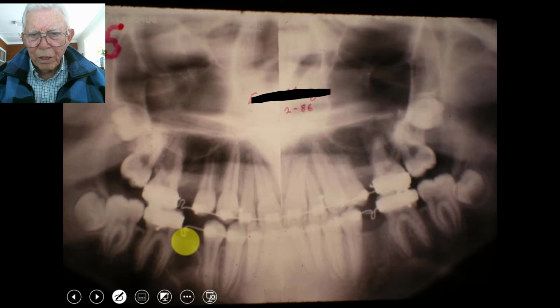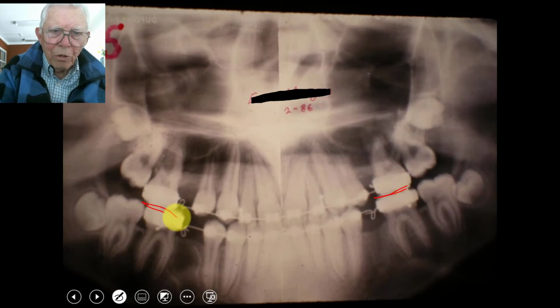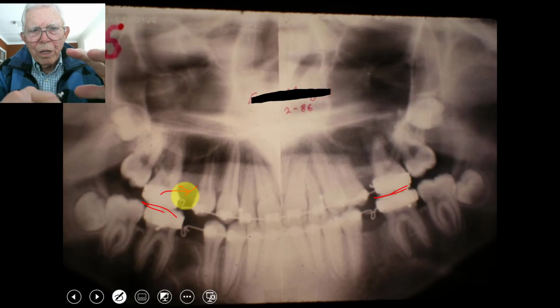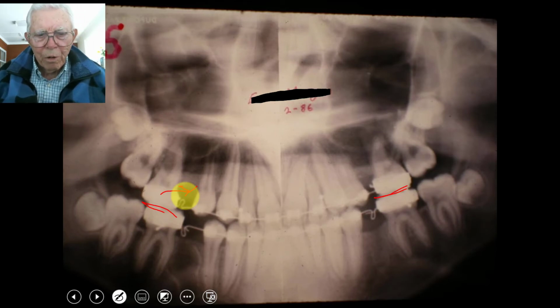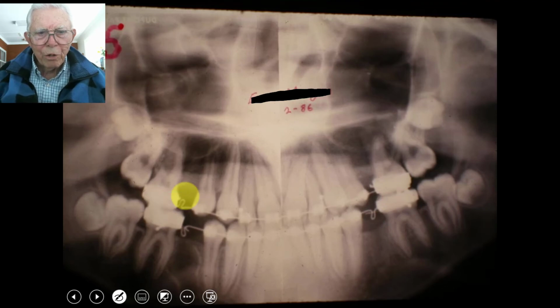All right, so all the second bicuspids are removed. Now this does several things. It puts all the swallow pressure on just a few teeth in here, and you could get the vertical height to change a little doing that. And if you take the tooth like this and move it forward, it's kind of like having something and you move it, here it will lower to some extent. So these are little tricks to get the vertical height of the face down like you want it.